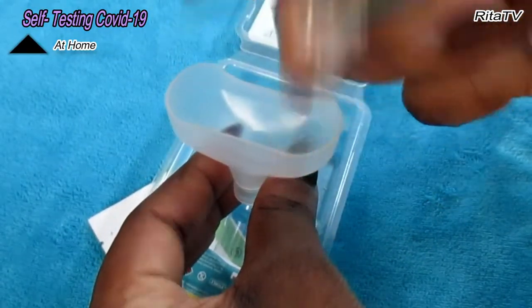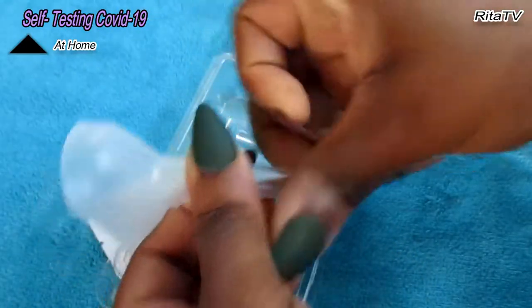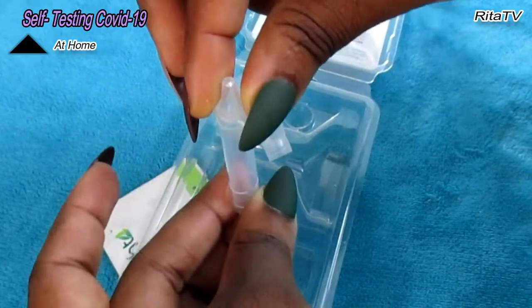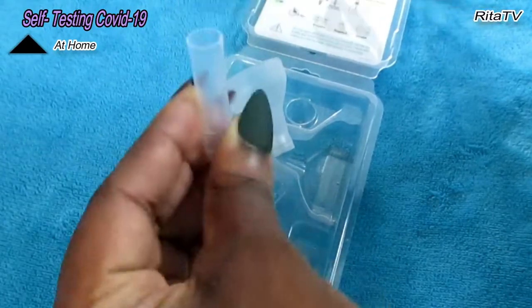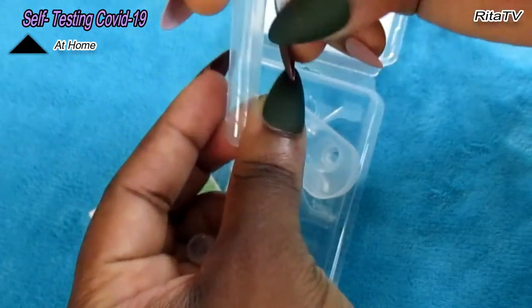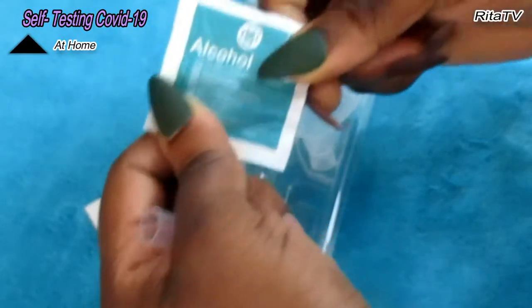Then we'll have the cover, and this one is where you spit in and put the cover on like this. You spit in through the funnel. Then after the spit is inside the buffer, you close it using this cover. Close like this. Before you close, you have to add this fluid. You have to add a solution to your spit inside of it. I will not be spitting on camera. I'll come back and show you how it is. So what else do we have here? We have the alcohol pad.